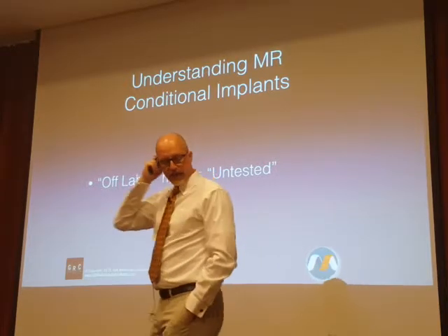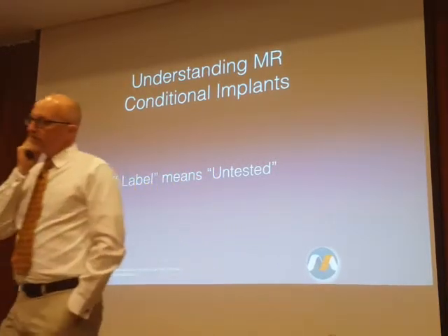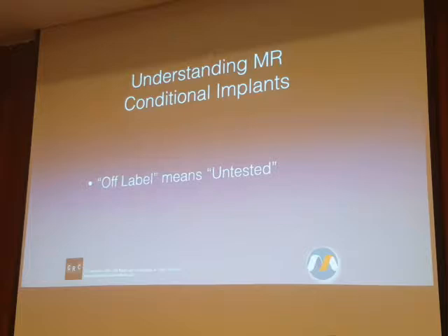Actually, I'm going to go back here for a second. So I asked you to ask those three questions about exposures: static field, time varying gradient, and radio frequency exposure to an implant or device.